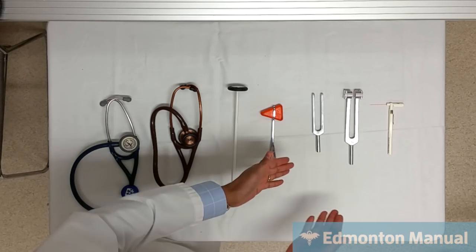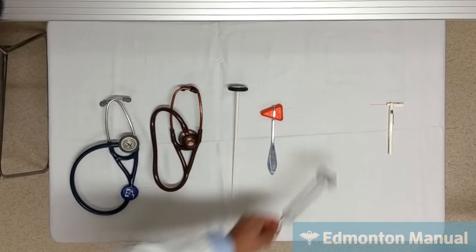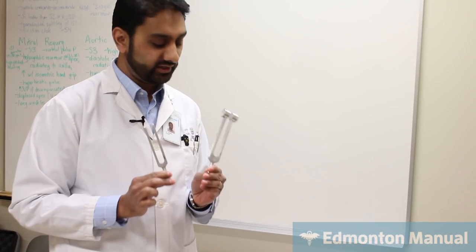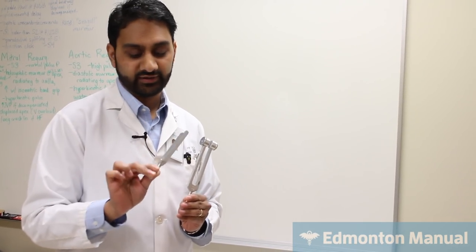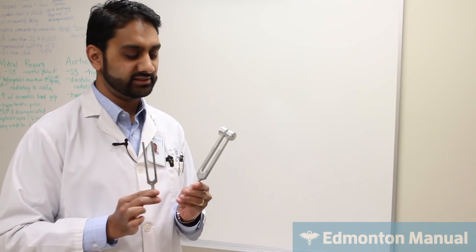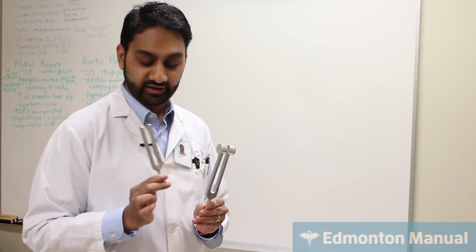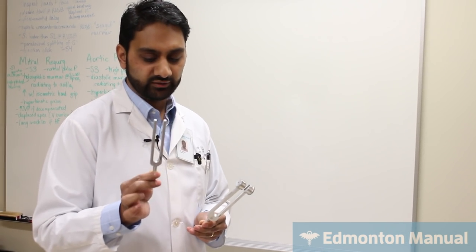So what we have here is two different tuning forks, and it's important to know the difference between the two. For those of you who play piano, middle C, if I remember, is about 256 hertz. The smaller tuning fork is one octave higher, 512 hertz, and the larger one is one octave lower at 128 hertz. They don't always actually hit middle C, because I don't know if the rigor of creating them is quite what a musician would want, but they're fairly close and they meet the purposes they respectively have.